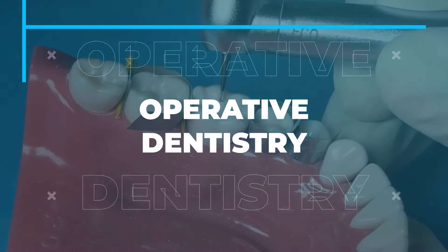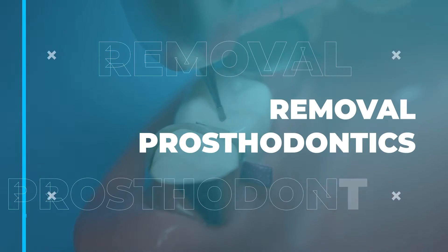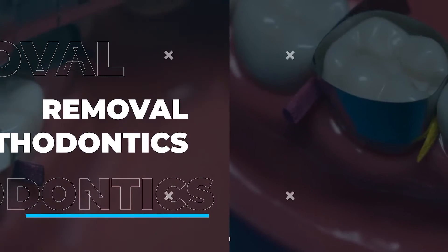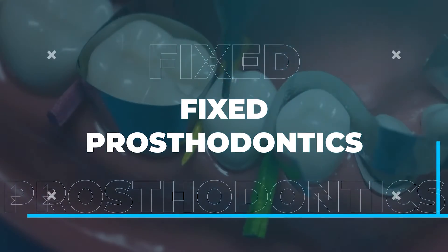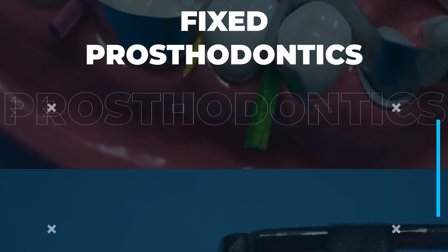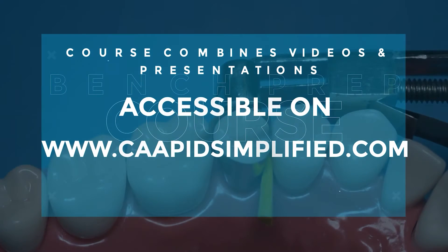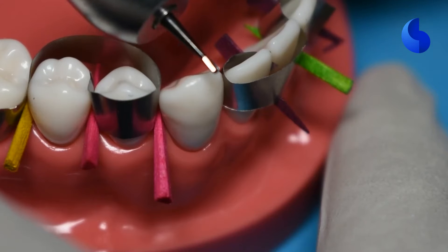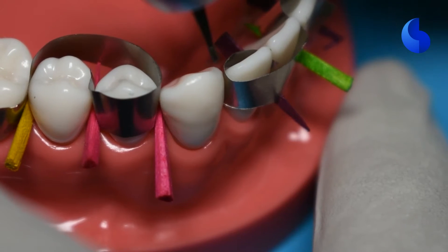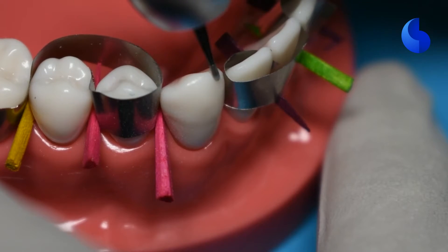In this video, we'll look at all-ceramic crown preparation on tooth number 27, the mandibular canine. So it's an anterior all-ceramic crown preparation.